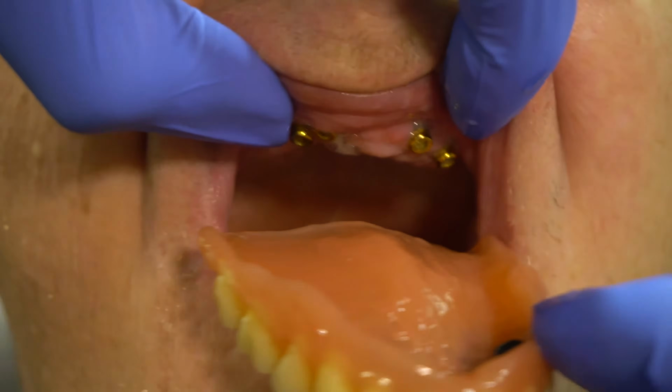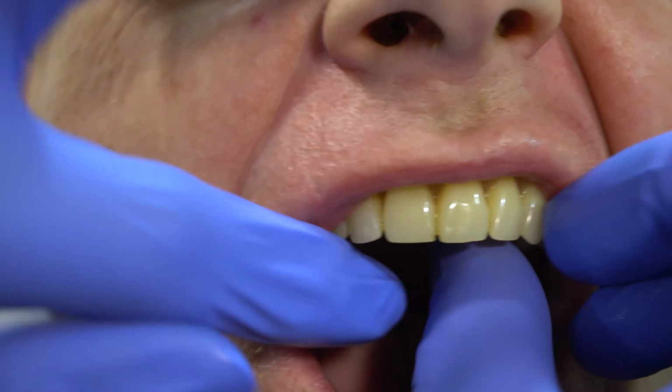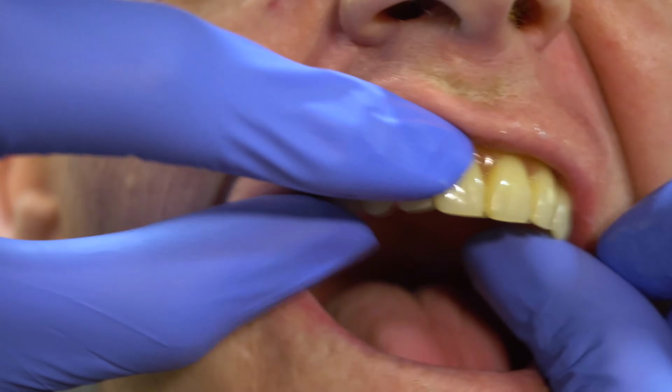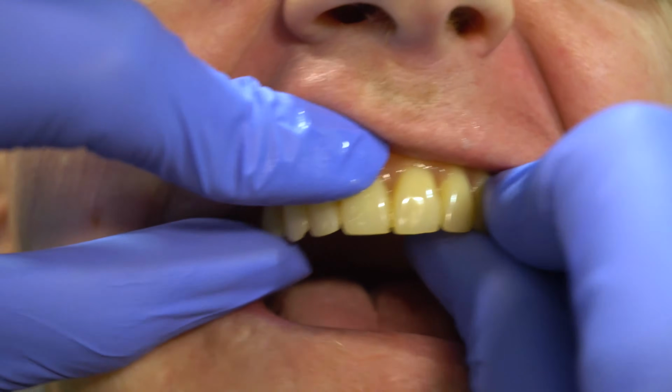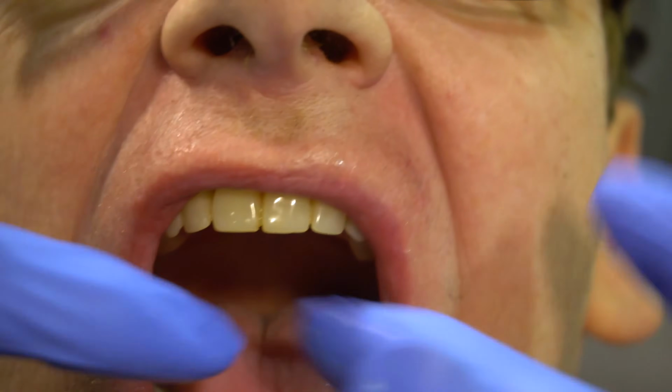But if we look at our mid-range options, our mini implants and our normal implants with locator attachments on them, these are the same thing. They're dentures, but they click into position. They are much better at resisting the forces that want to move the teeth out of position. So remember the muscles which are trying to do their job, but as a side effect, they're pulling the dentures out of position.